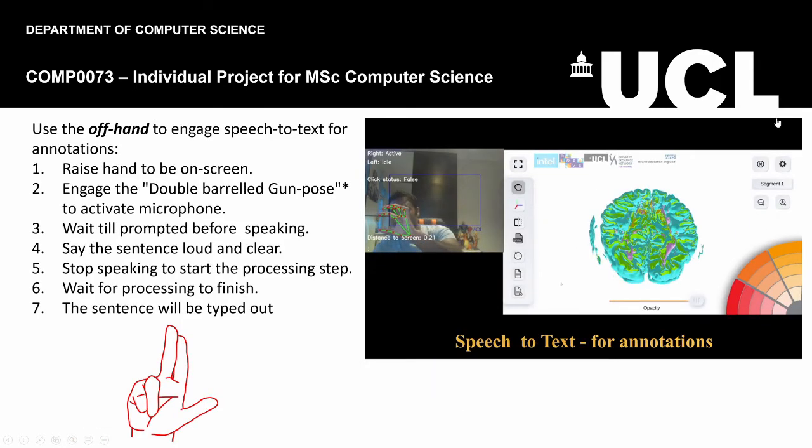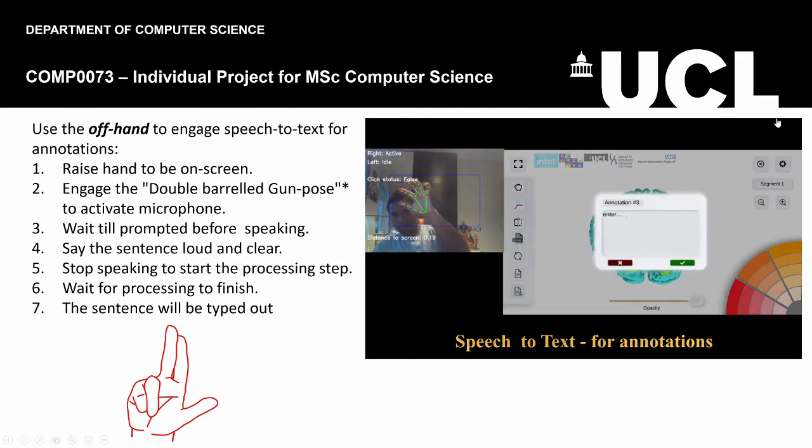Lastly, the HoloRepository Viewer also allows for the creation of annotations, and for this I needed a way to get text on screen without touch, so I opted for speech to text with this option. And all you need to do is engage the double barrel gun pose.